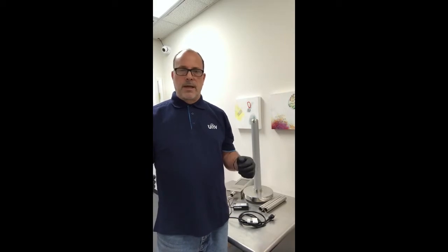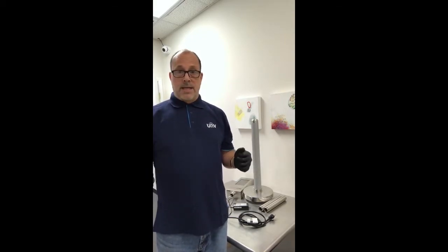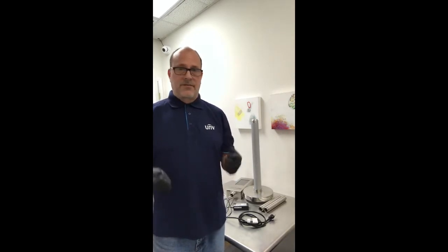Hi everyone, I'm Brent with Ellipse Security. Today we're going to be talking about the OTC513 non-contact temperature screening system from Uniview and how easy it is to set up, deploy, and be reading temperatures in less than 10 minutes.